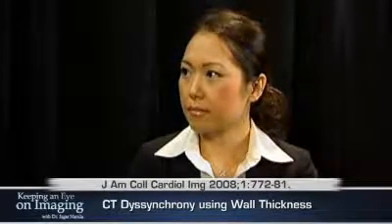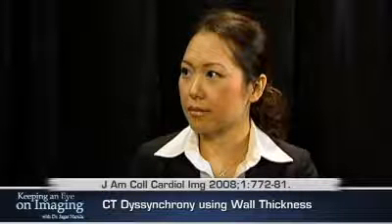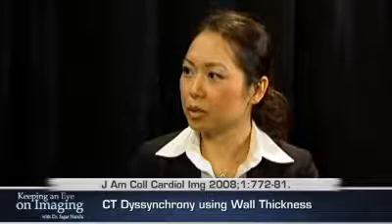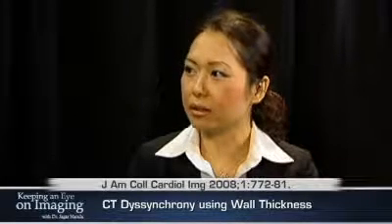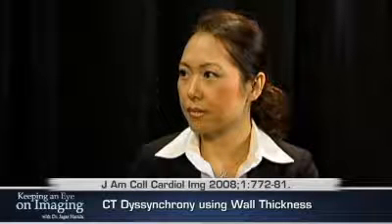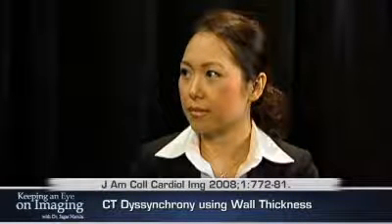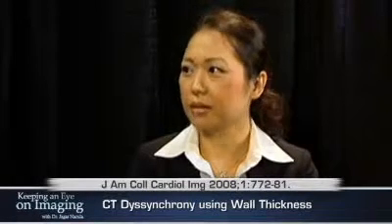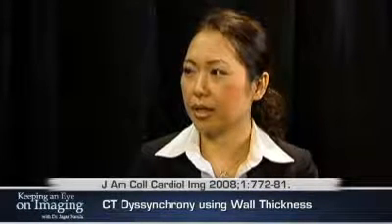This sounds like a very complicated measurement. Can this be automated in some way? Well, I think there's more to be done in terms of software automation, and there's lots of improvement in that area. So your hope would be that this would be a parameter that CT can deliver to better identify patients who will profit from resynchronization. But so far, prospective studies have not been performed.